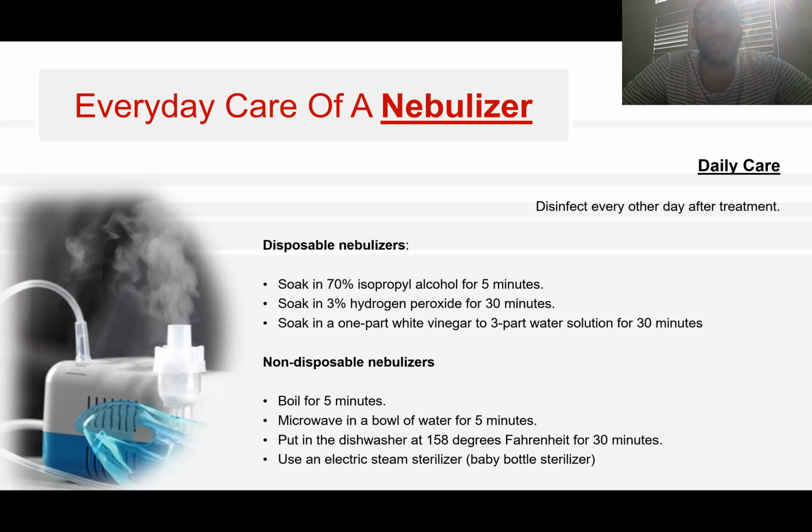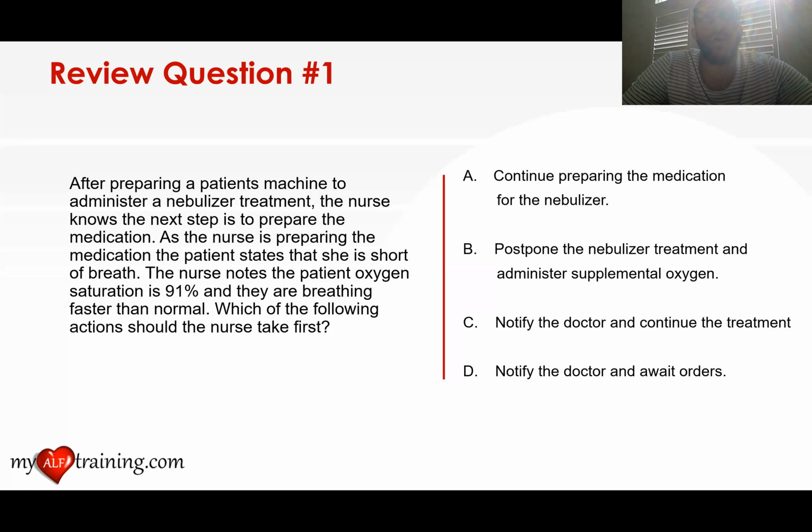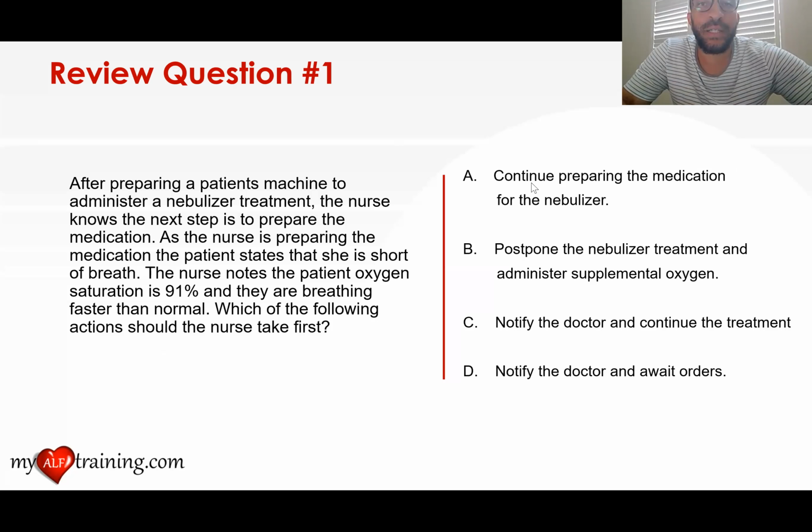Non-disposable nebulizers, if the patient is in a very independent living facility and they are just starting with the nebulizer and you're teaching them about how to clean and care for their equipment, and it's a non-disposable, then show them how to boil their pieces for 5 minutes or microwave in a bowl of water for 5 minutes. Very simple ways to clean and keep them germ-free and disinfect these pieces so that when we go to use them, they are not contaminated with bacteria, and then the patient inhales this medication and becomes sicker than they were before.